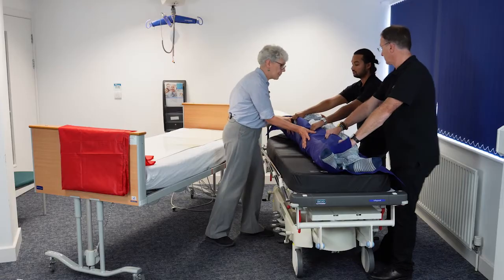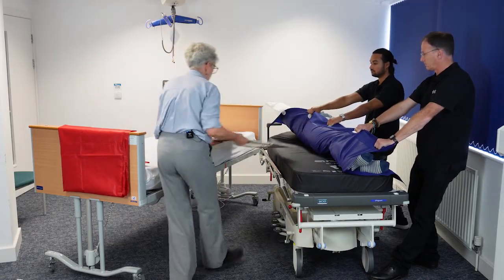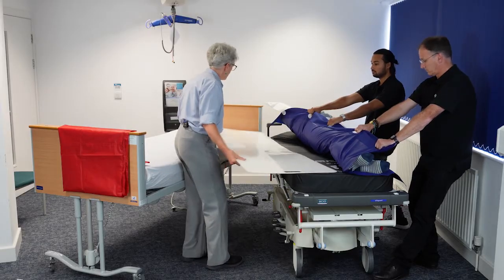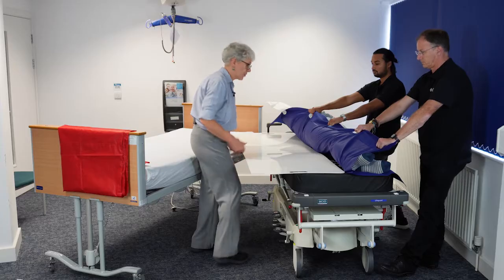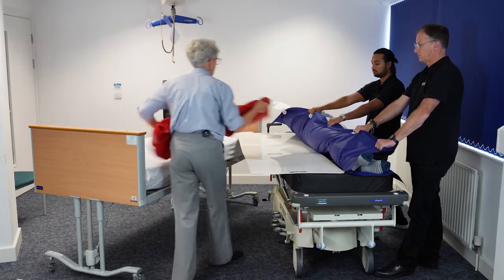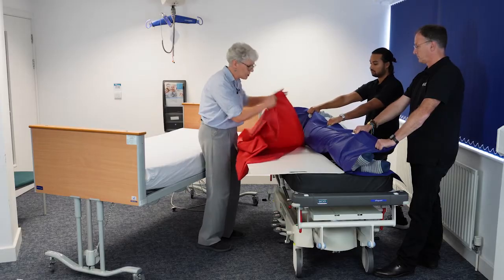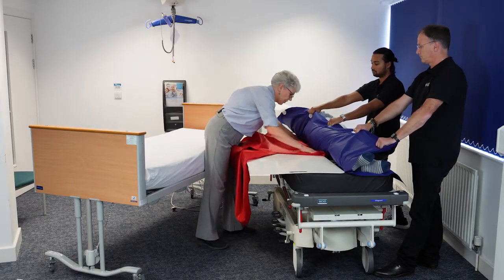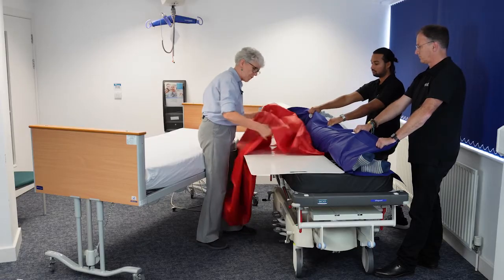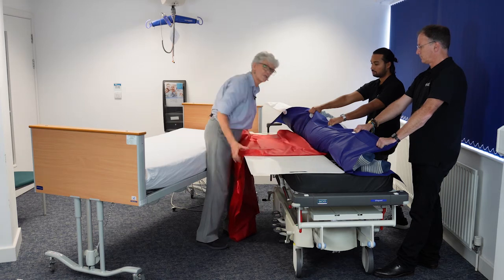If you could just very gently lean them over to your side — lovely, stop there. I'm going to position my transfer board. This is just acting as a bridge between the two surfaces, so it doesn't need to go completely under the patient. Then I'm using a slide sheet on top of the transfer board but underneath the transfer sheet.